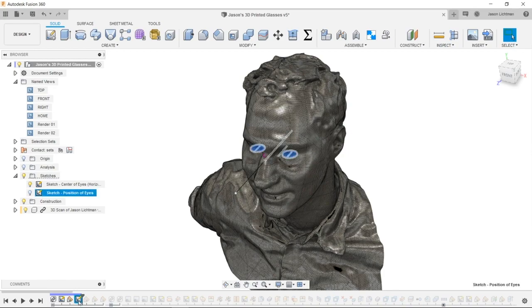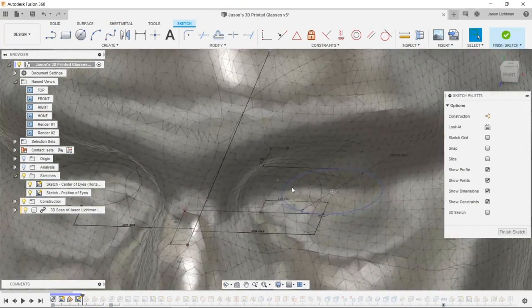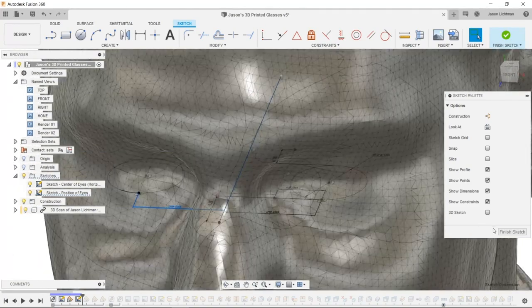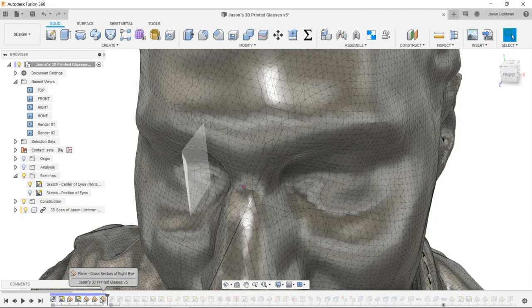On that plane I drew a sketch showing the position of my eyes. I drew a circle approximately the diameter of my eye — the diameter doesn't really matter, it's more about the position of the center of my pupil. I also put in the distance from the center of my face to each pupil. Then I added planes for the cross section of my left and right eye, and allowed myself to move the center of the lens relative to my eye for aesthetic reasons.